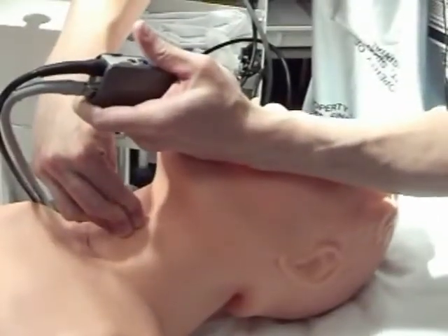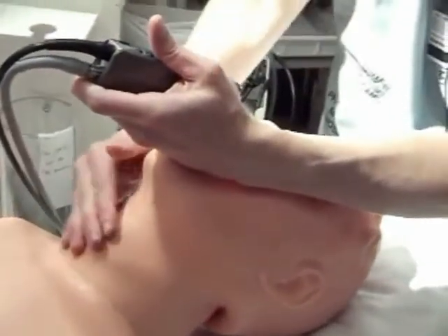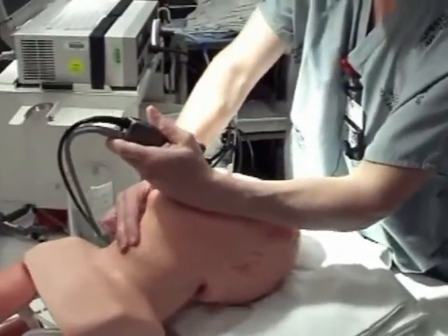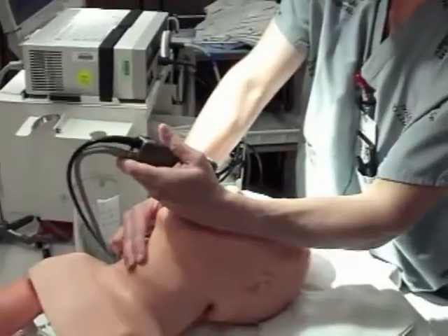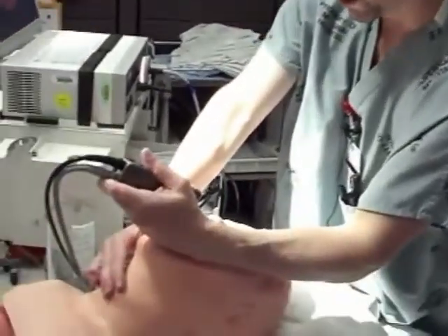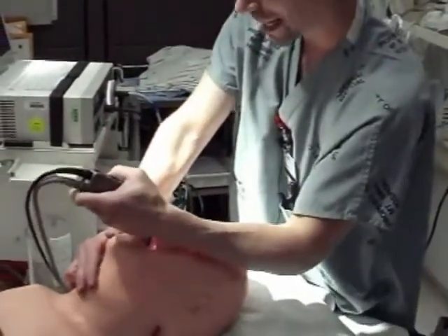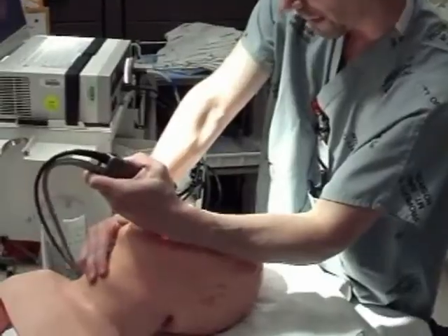My blade is now seated in the vallecula. This is the first time I'm actually going to be applying much pressure to the laryngoscope blade. At the same time I'm lifting up with the blade, I'm pushing down with my fingers on the thyroid cartilage — that's bimanual laryngoscopy. What I'm looking for is the posterior notch. When I see the posterior notch, I know I've identified the cords. If you're not finding it, don't go on — that's how you wind up in the esophagus. Keep lifting until you see the posterior notch, which is the most posterior structure of the airway. Once you see the notch, optimize your view with more external laryngeal manipulation and lifting until you have a great view of the cords.